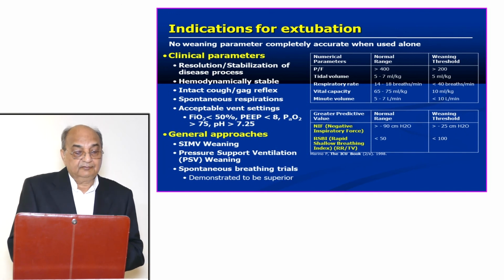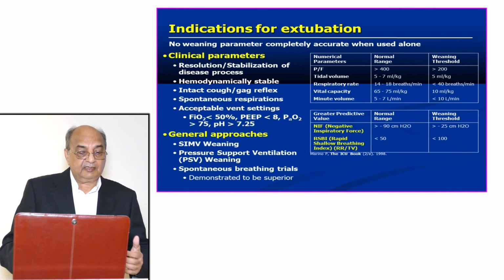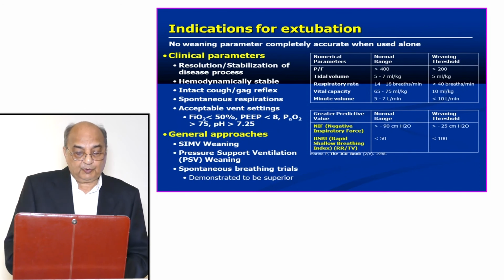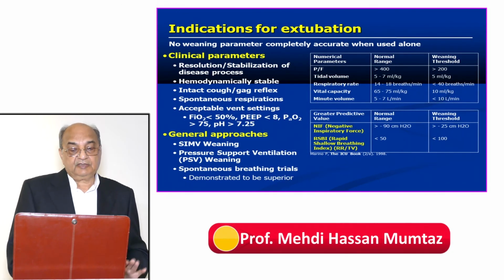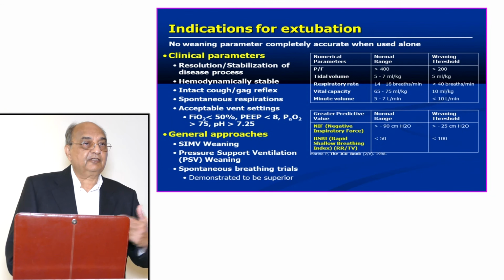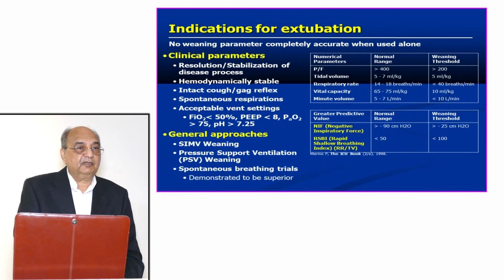Now you have already tried the SIMV mode, you have already given the BiPAP. Now the patient is on spontaneous breathing trial also, and the patient has passed through that. Now the patient is ready for extubation. Now you extubate the patient and immediately put the mask on, and you humidify the patient after extubation.